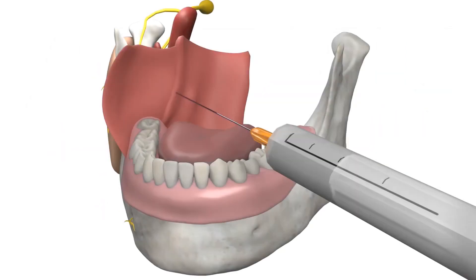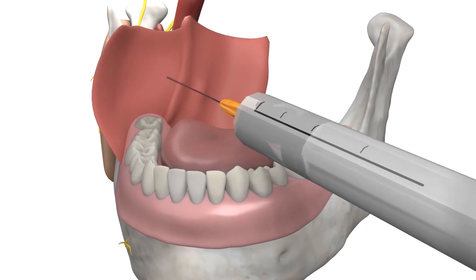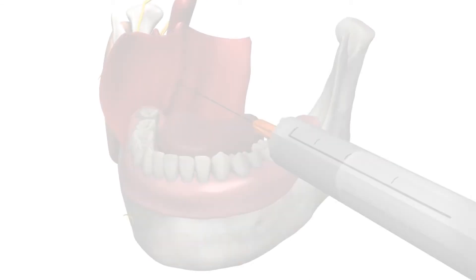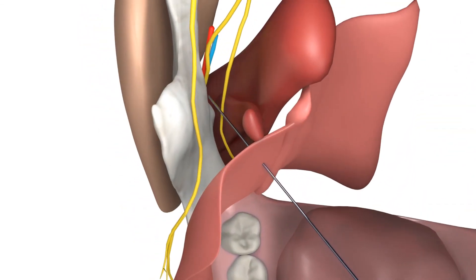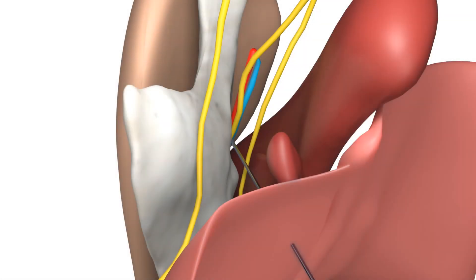Here we have a 3D model of the procedure. After identification of the landmark and the site of injection on the patient, introduce the needle until it makes contact with the bone. Retract the needle slightly, aspirate to ensure you are not in a blood vessel, and inject the anesthetic. The same procedure is shown from another angle to highlight the anatomy. The nerve running just inside the mandible is the inferior alveolar nerve. Note the nearby vein and artery, highlighting the importance of aspiration.